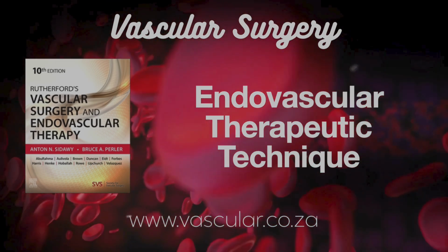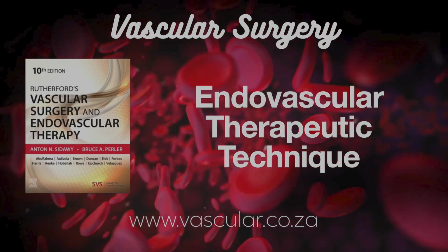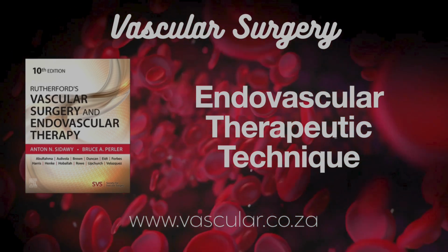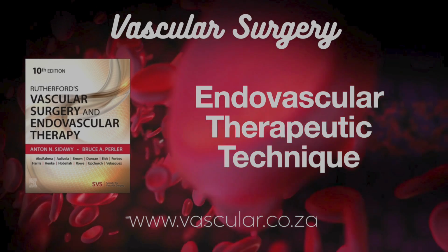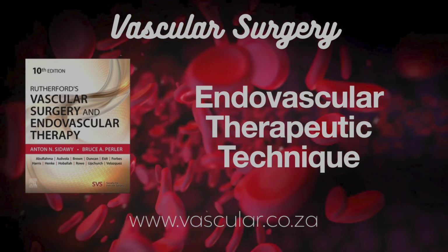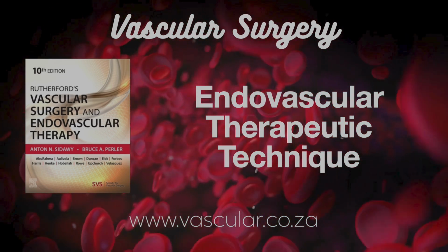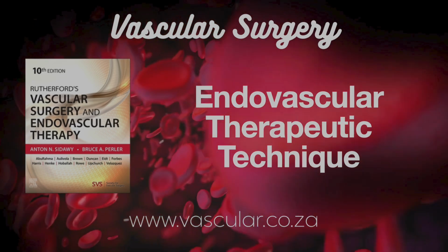Clinical results. A study in critical limb ischemia showed high success rates, restored flow to the foot, good patency, and limb salvage out to 2 years. For in-stent restenosis, one trial found laser plus PTA was better than PTA alone. Fewer reinterventions at 6 months, lower adverse events. A systematic review also suggested adjuvant laser might be better than standard angioplasty for ISR. Trials are ongoing to figure out its optimal role. So quite a toolkit for plaque removal, each with its niche.